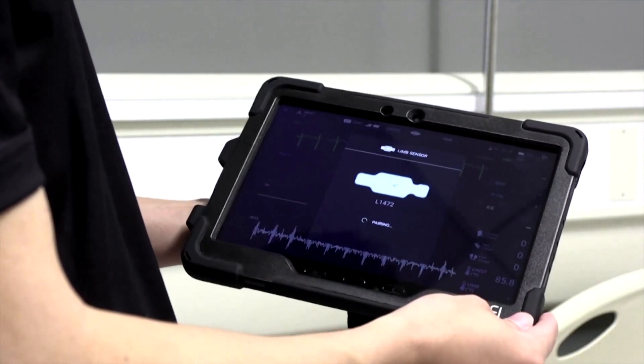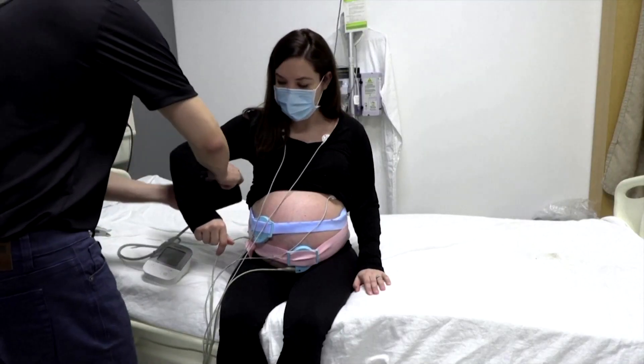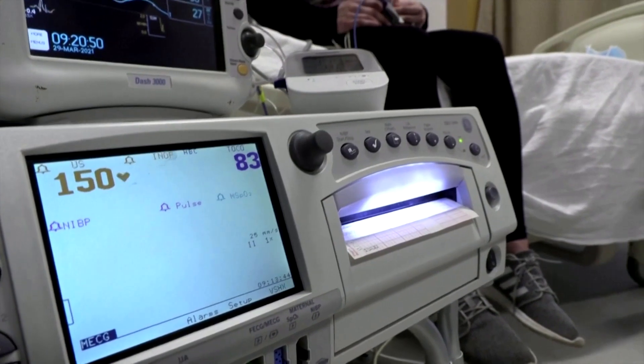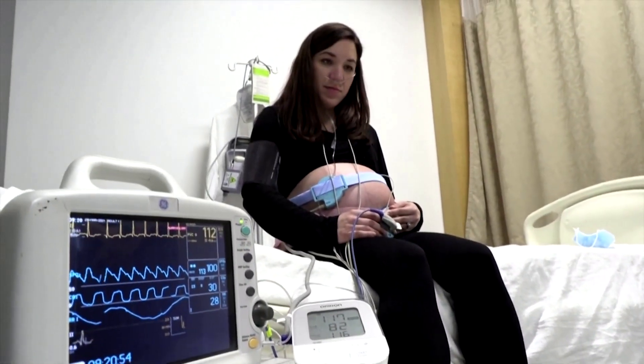Once you stick them on, they have a better capacity to detect heart rate without constantly having to shift them every time you move. You're not tethered to the wall to this big unit that interprets all the information. It is incredibly liberating to have just a few patches that collect your information and the baby's information, and not feel that you're trapped in all of these wires.